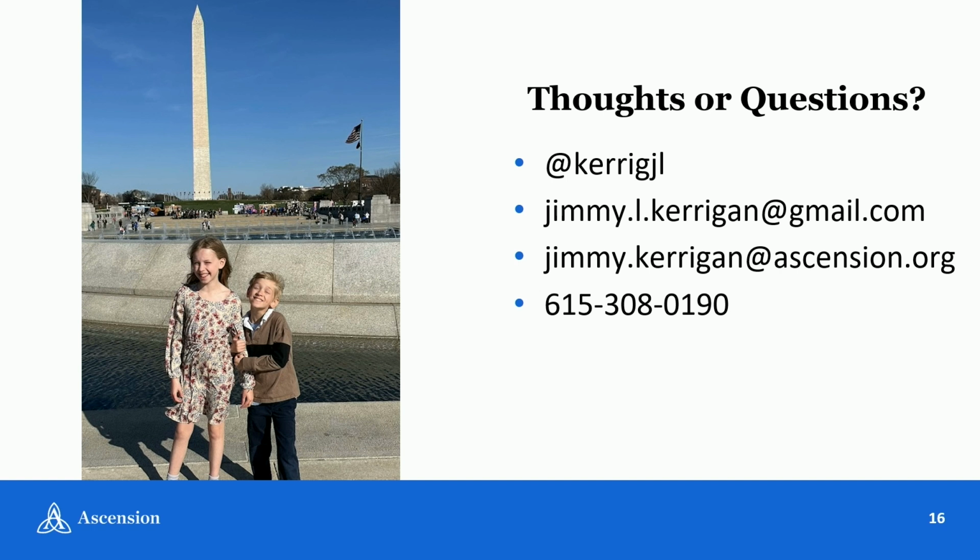Great sessions and really great talks. But I think we're facing a similar challenge in many programs. For instance, in my program, we deal with 6, 7 different sites, and each is equipped with a very different level of technology, from old 64-slice scanners all the way to high-res photon counting scanners. So the end product is that we deal with very different resolution. And so it affects greatly the stenosis assessment, as well as probably more so the quantitative plaque burden.